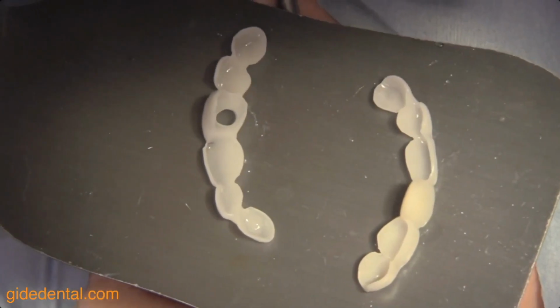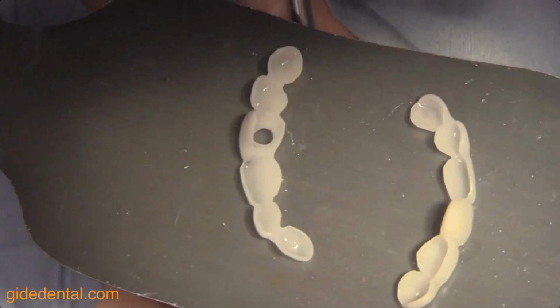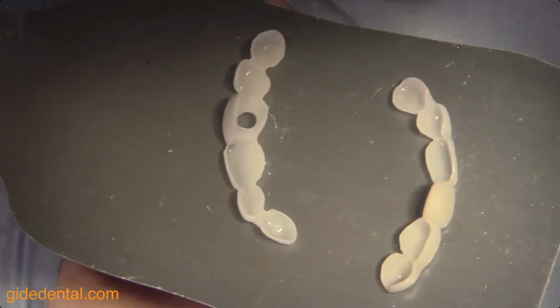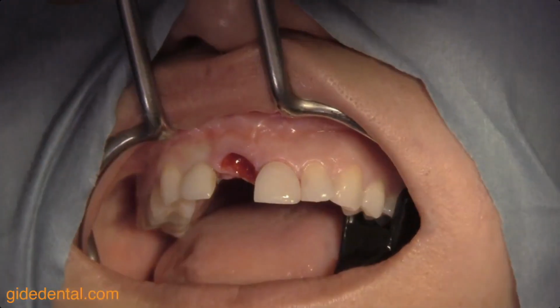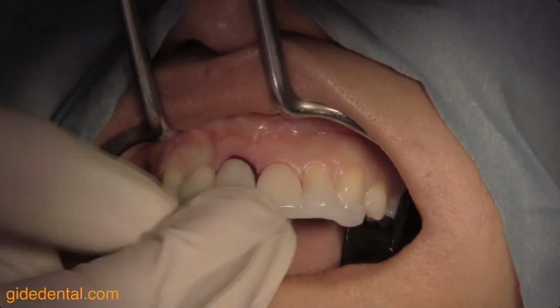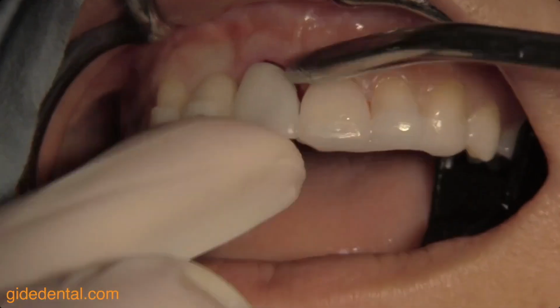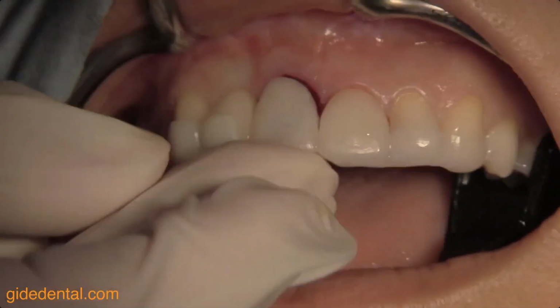This will be our surgical guide. And the second one could also be a surgical guide, but it can also be used as a shell for the temporary. And then we'll use that to fill this up. So now you can see the surgical guide being placed, really nice and stable on the adjacent teeth with these cantilevers, which are on the incisal edges.